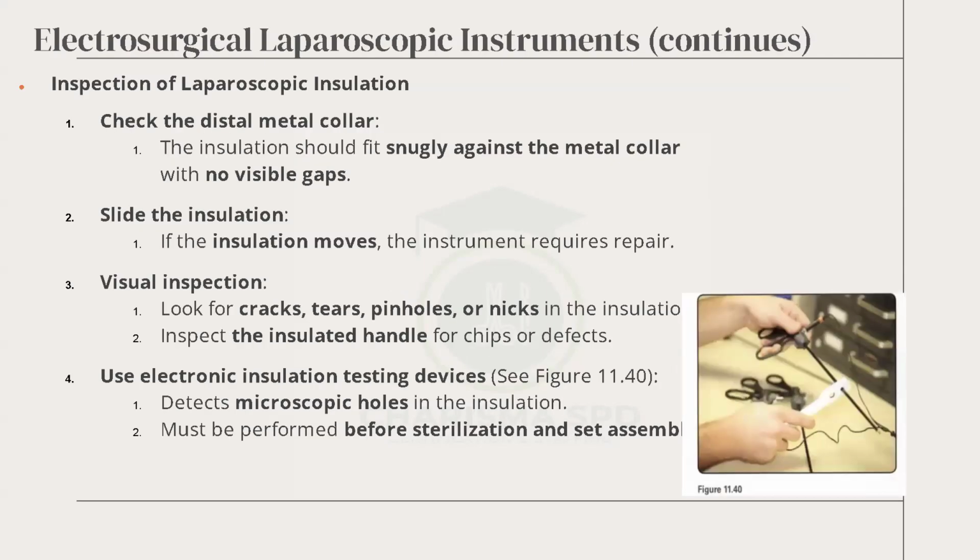Okay, there we go. So on the picture, yes, those are the laparoscopic instruments. This gentleman there is testing to see if there are breaks in the insulation. That white device is the tester connected to another device.